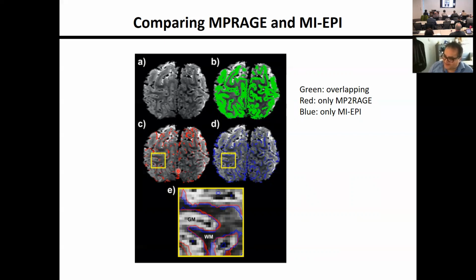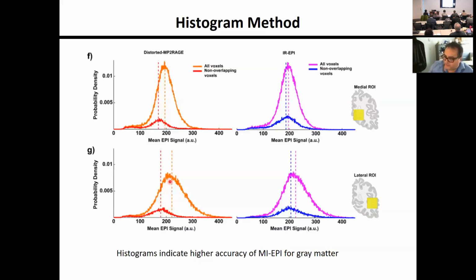But for an entire slab or an entire image, visual inspection can be misleading, so I would be very careful. But if you look at these images, here you have some white matter voxels, but most of them are in CSF, which confirms this behavior. But I would be really careful with visual inspection.